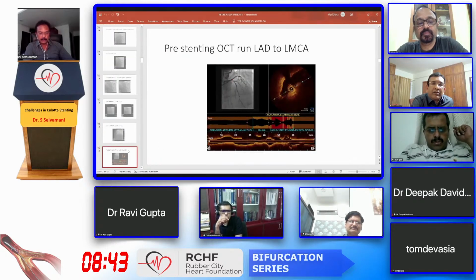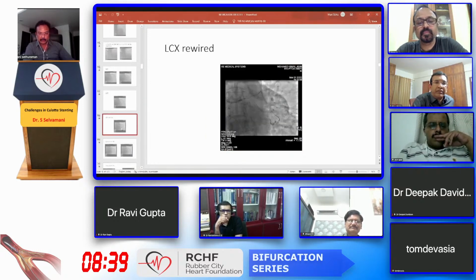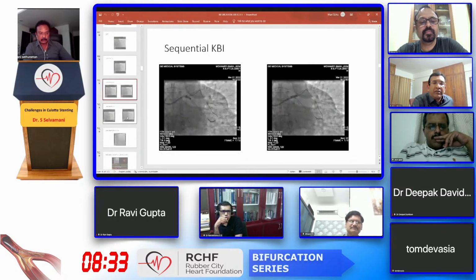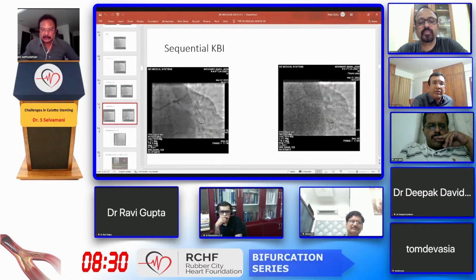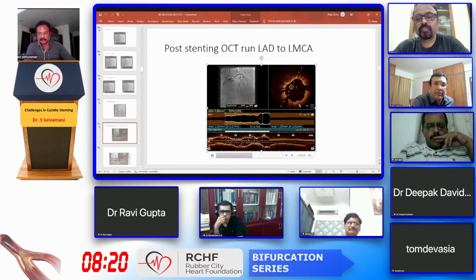And you get excellent results, but long-term results are awaited. And there is no need to recross again, and you will not lose the side branch at all. So that is one of the easiest ways of doing this bifurcation, but anyhow, it requires further evaluation.